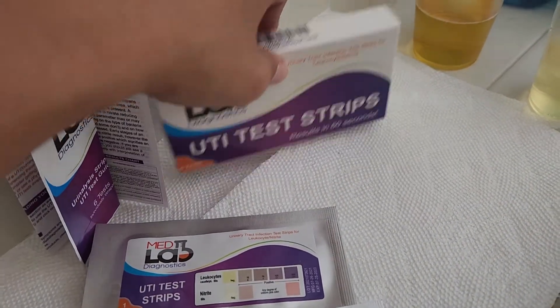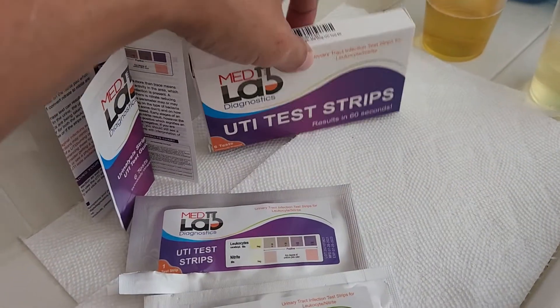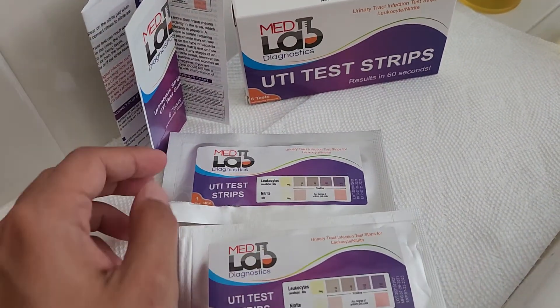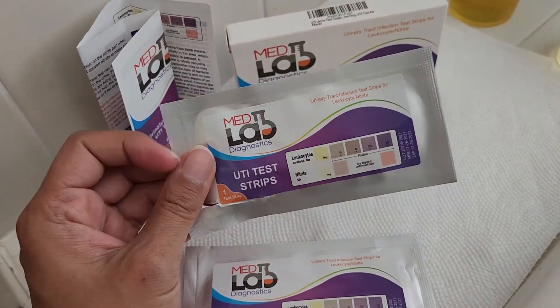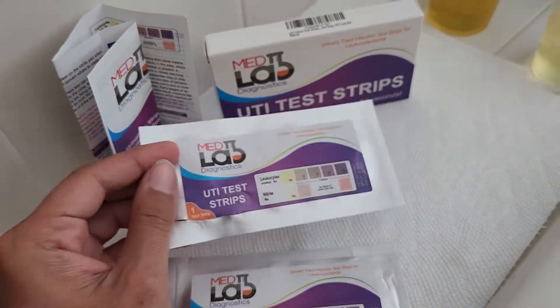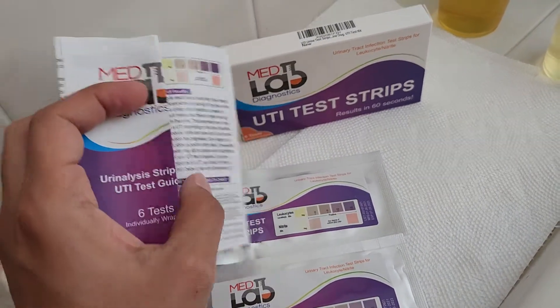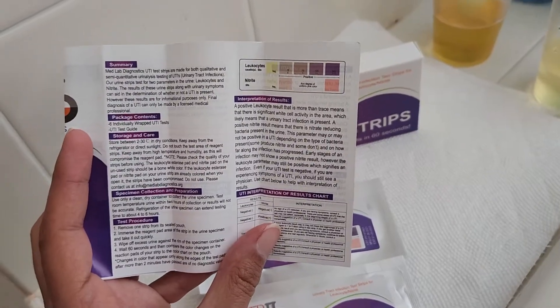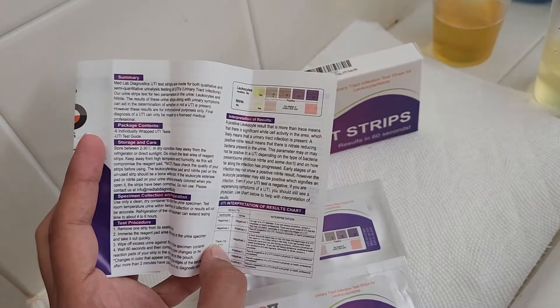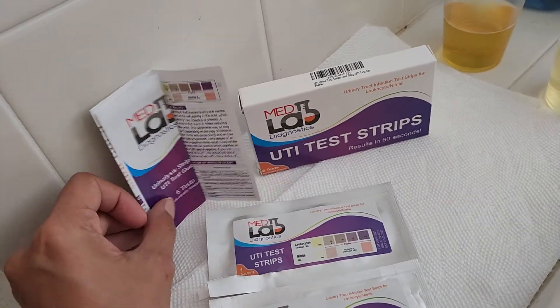Our test strips come in a box with six individually wrapped tests for maximum freshness. When you open the box you get the test strips individually wrapped like this, and the color chart will be right on the pouch. It also comes with a color guide that shows you the test procedure, how to use the test, and the interpretation of the results. There's a little chart here that will help you interpret the results and some basic information about UTIs.